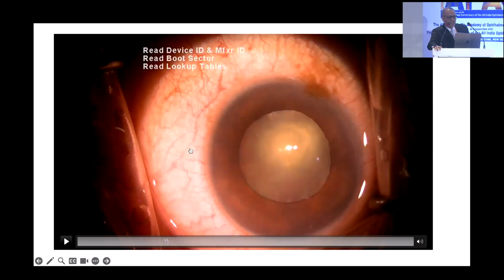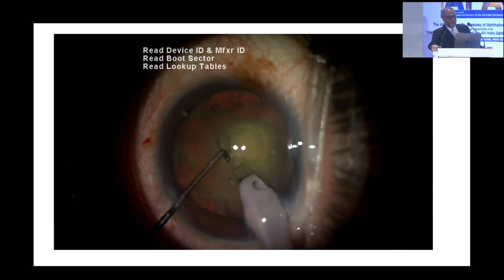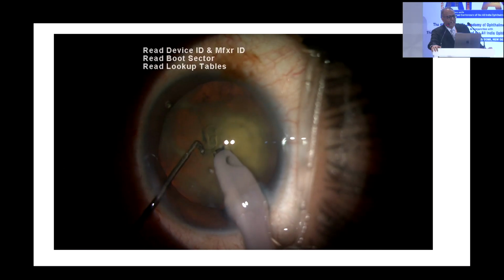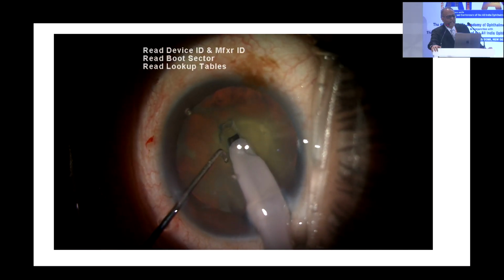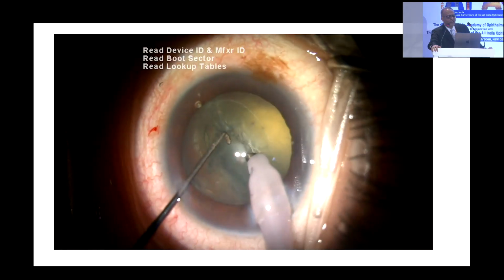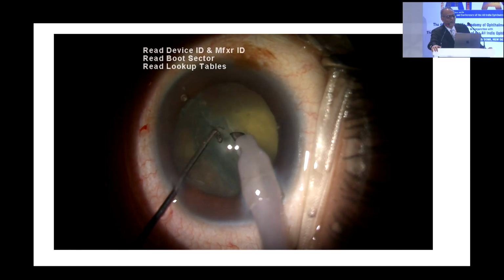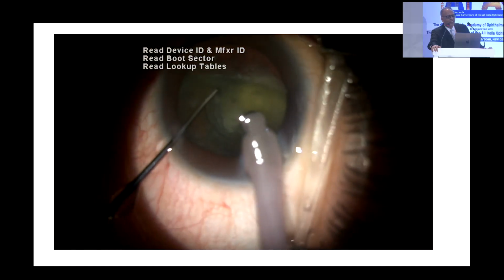So this is another situation wherein it is a posterior polar cataract. It's a very old movie. I'm going ahead doing my bit of sculpting, pushing the nucleus, which should not have been done. It's a very deep chamber, trying to create a situation where I would do cross chopping, and I crossed everything, the limits, and you will find that suddenly it has gone behind.